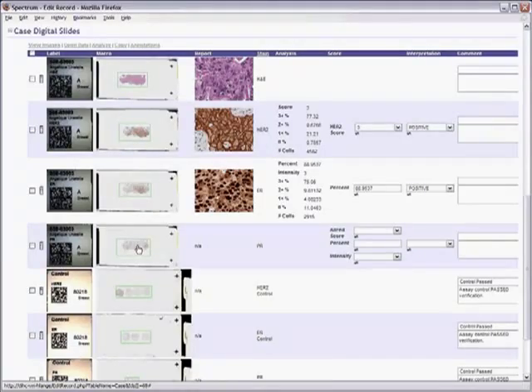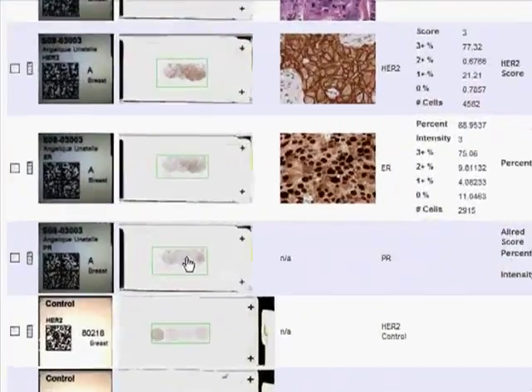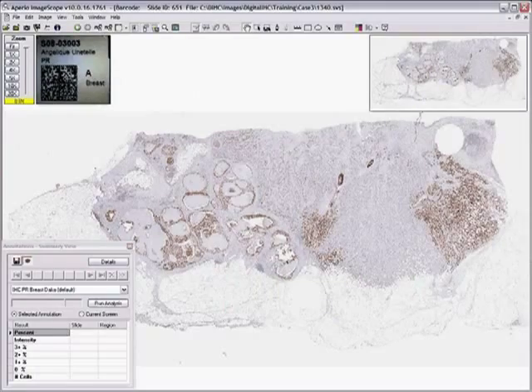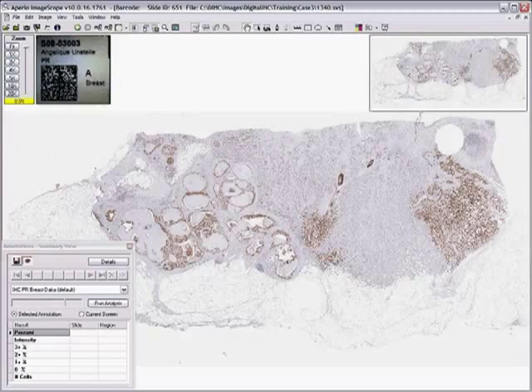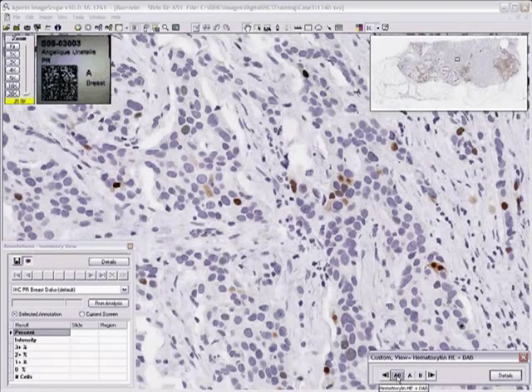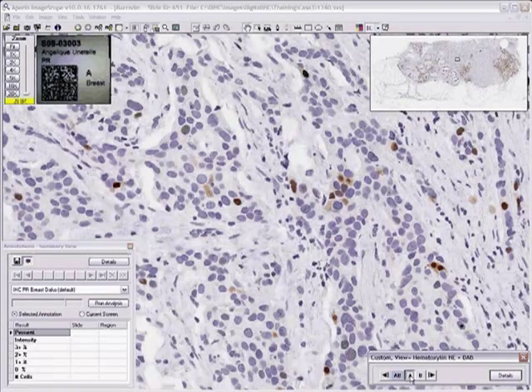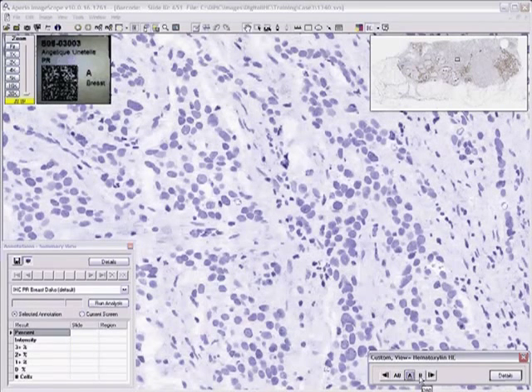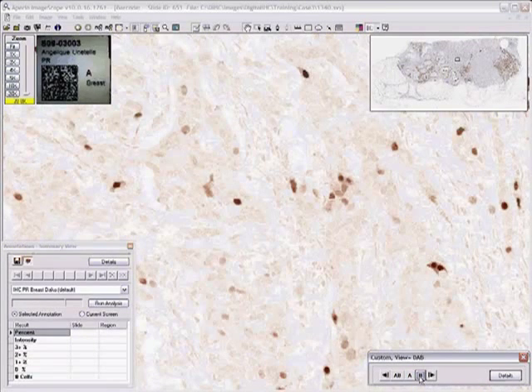And designate your report image. Open the PR slide and take a look at the different stains separately. Hematoxylin and DAB.